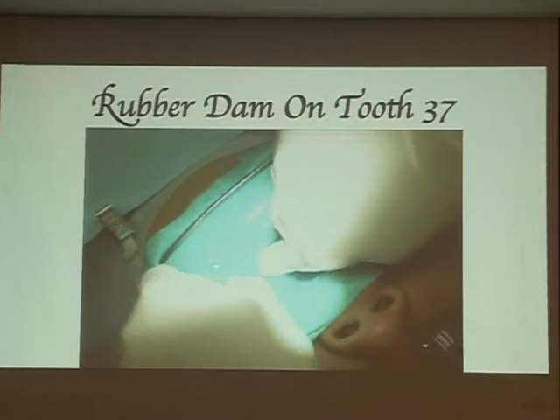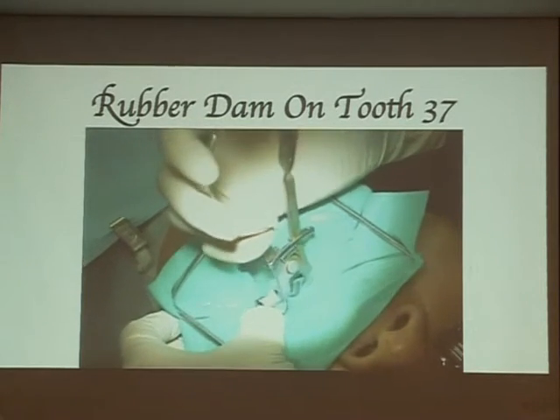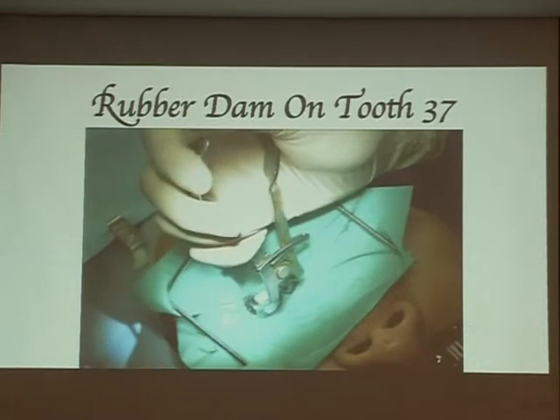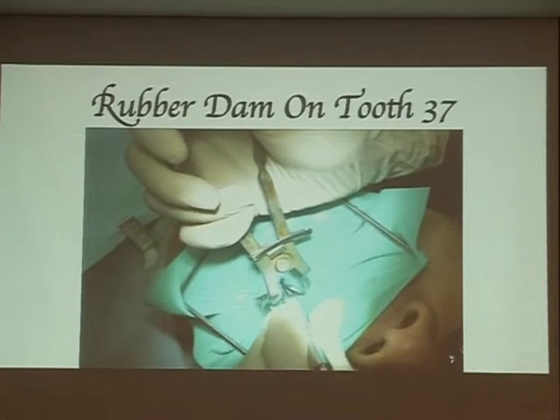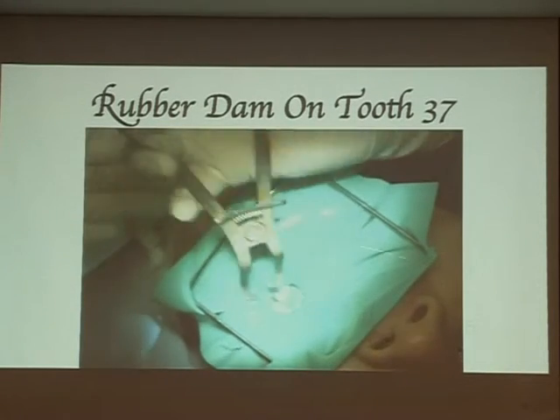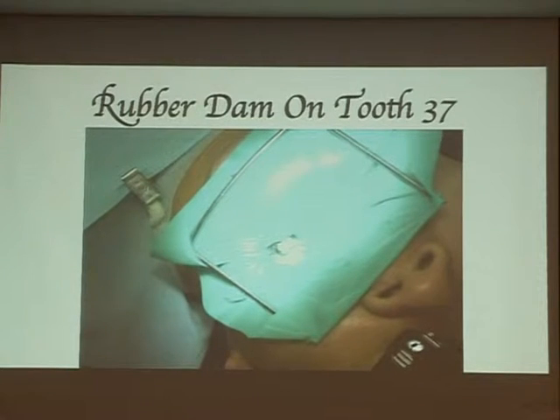Even so, I'm trying to make sure that the rubber dam does not leak, so I will adjust the clamp to make sure it's not leaking around the rubber. It takes about 40 seconds, up to down. So it is important to spend this one minute, I would say. Once the rubber dam is on, you can relax. The patient cannot talk, okay? So you can stop the patient from talking.